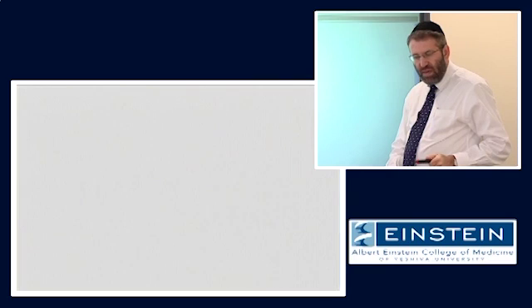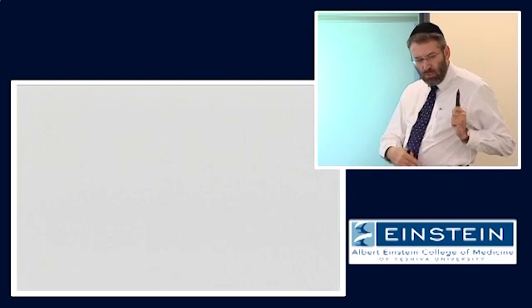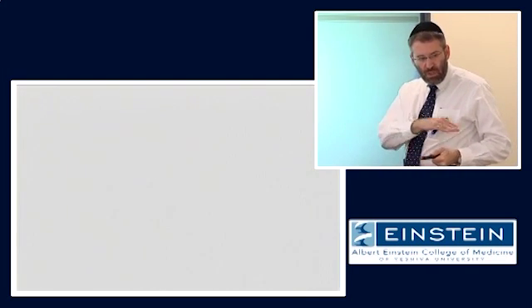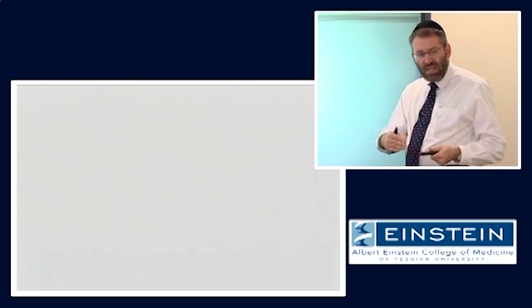After 3 to 4 iterations, we get into what we call a steady state, where the magnetization on each successive TR will recover to the same point. Each time we will generate the same amount of transverse magnetization, corresponding to that degree of recovery of longitudinal magnetization that occurs on each iteration of the TR. And this is what we call the steady state signal.